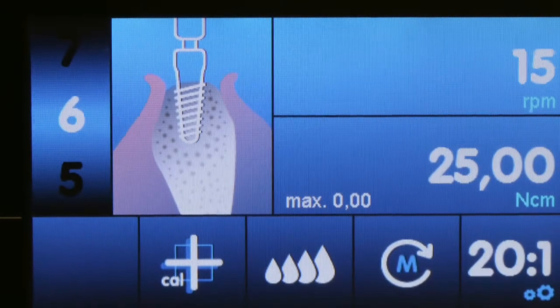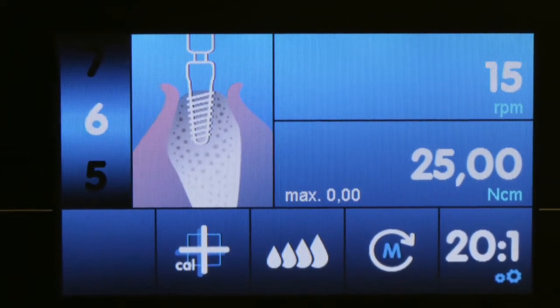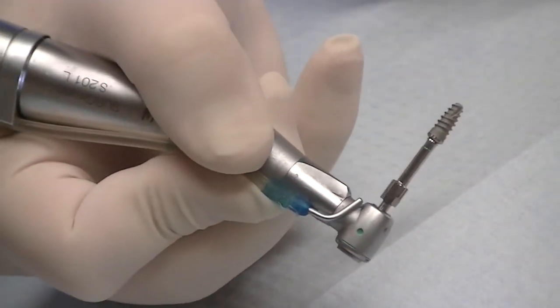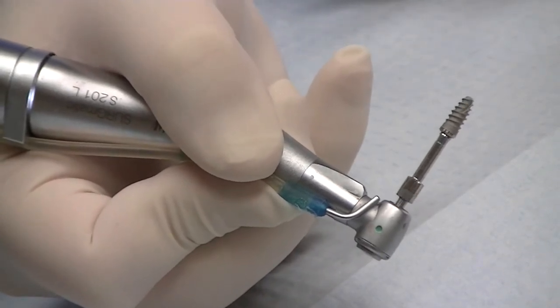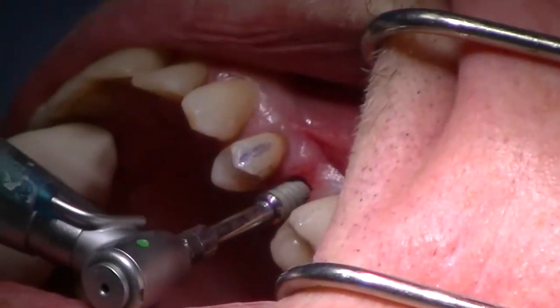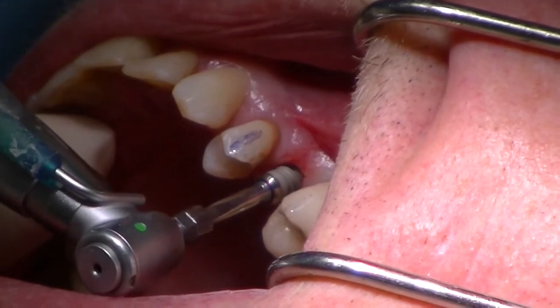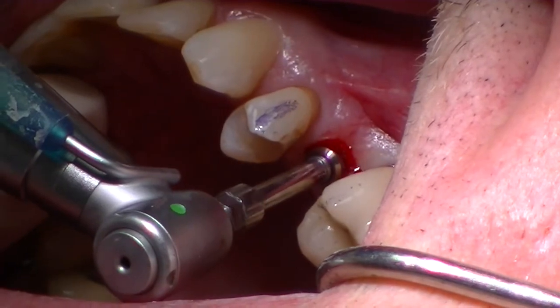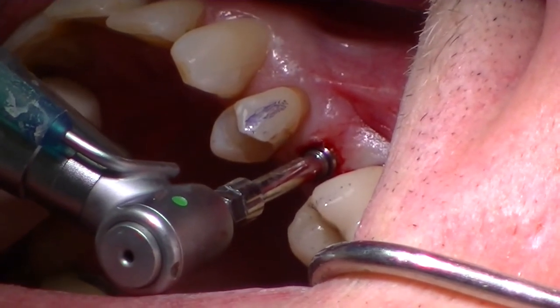Now I'm going to place my implant and slow my speed down on my motor to 15 newton centimeters. These implants are one millimeter longer than the drills. We're going to very carefully, very slowly engage the implant. I want you to stop right at tissue level — we're not going to go subgingival. We're going to stop right at tissue level. Now we know the implant isn't completely seated, and you can see that.